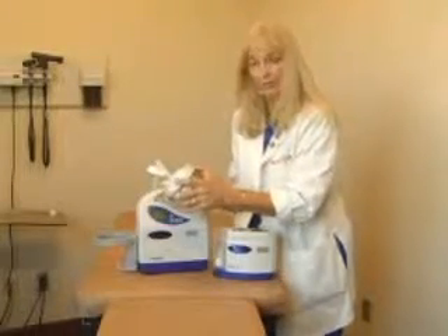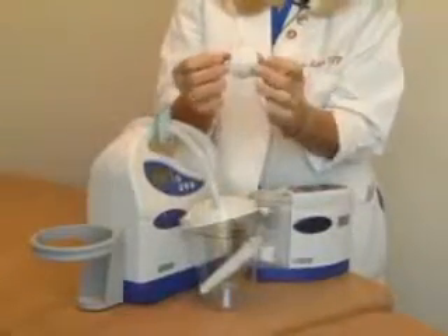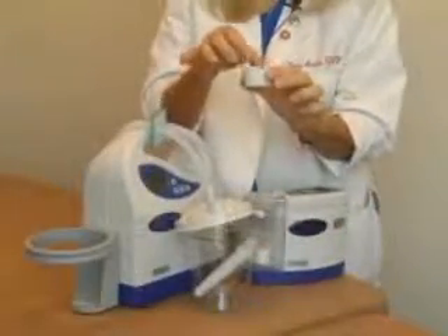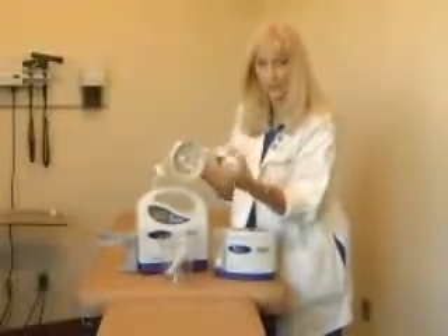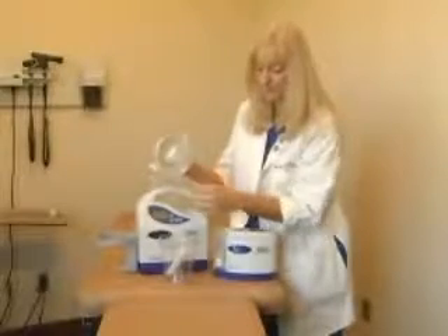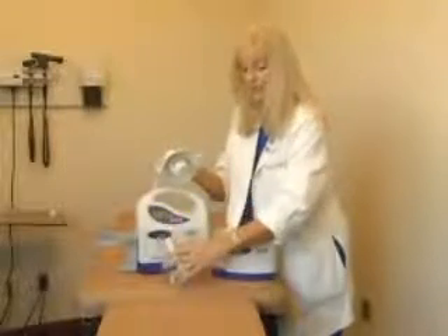Should the canister lid become detached in shipping, it can be easily assembled by attaching the internal float valve. The internal float valve is what is lifted as the exudate reaches the 750cc marker — the float valve lifts and it shuts off the pump. Should this become detached in shipping, these three small teeth very easily snap into the top lid.